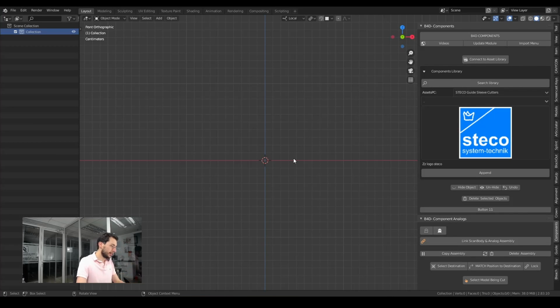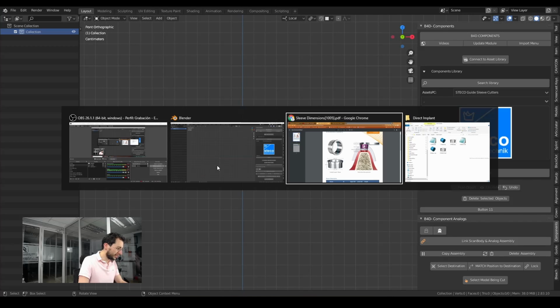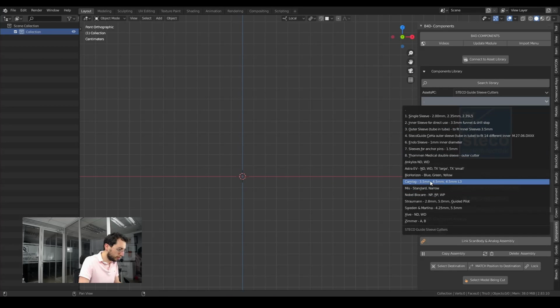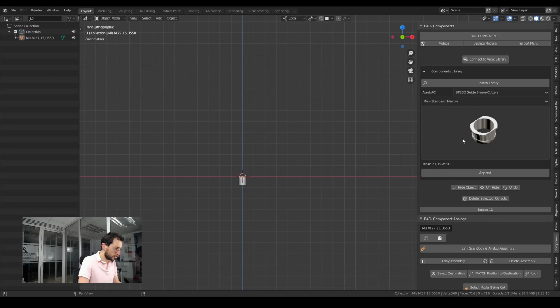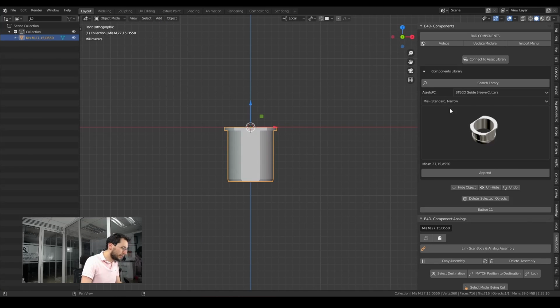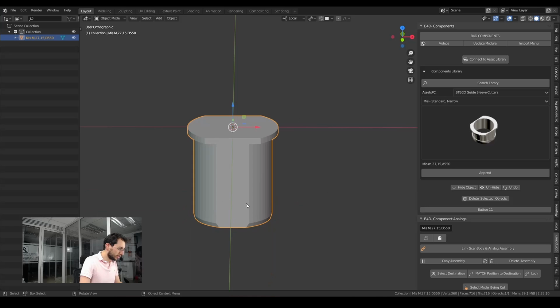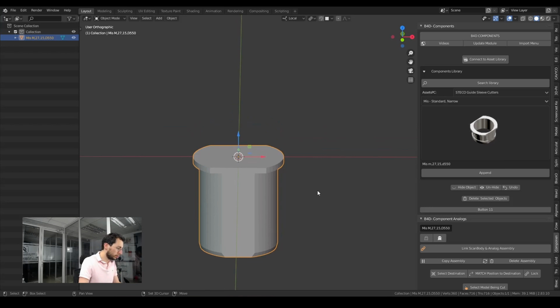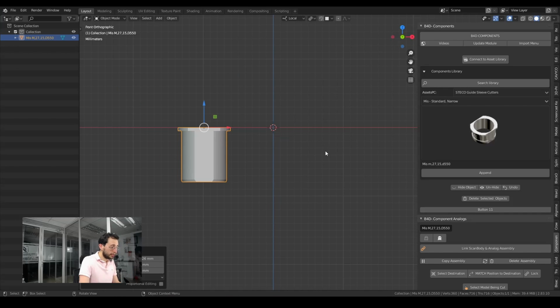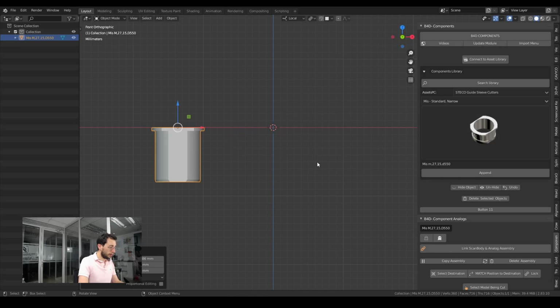Well, this is very easy, and it can be done with the correct dimensions. What we need is exactly what I have here in this catalog, which are the dimensions of this cylinder. So if I import now one example, this one, MIS, let's say, M-I-S, however you say it, in Spanish we say MIS. Anyway, if I import this one, you may see it is a solid model. It has no hole in the middle because this model is just a cutter for the guide, and when we use this element, the guide will have the space for the sleeve, and the sleeve will fit perfectly in place.